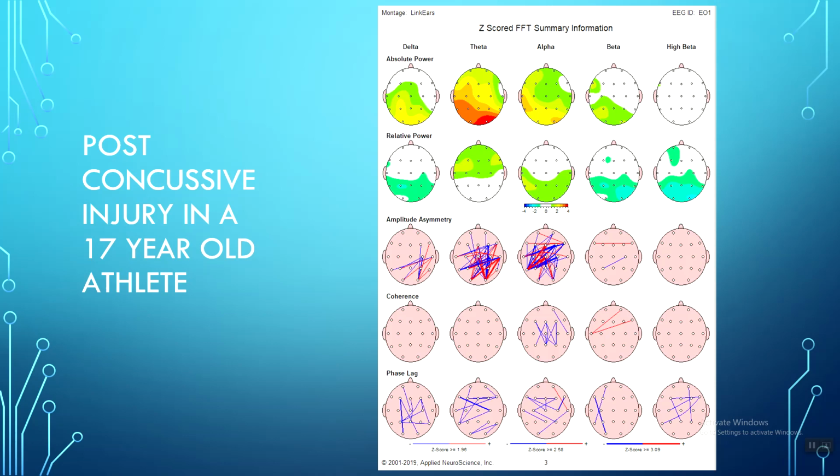When you have 2 or more medications on board that are psychotropic, then you have a synergistic effect between the two, which is unpredictable. And so when someone has 2 or more medications on board, it's more difficult to see how those are affecting the EEG. One blend that's a real crappy blend is a blend of sedatives and hypnotics that will slow somebody down significantly. And so you can make a guess about what different medication classes will do.